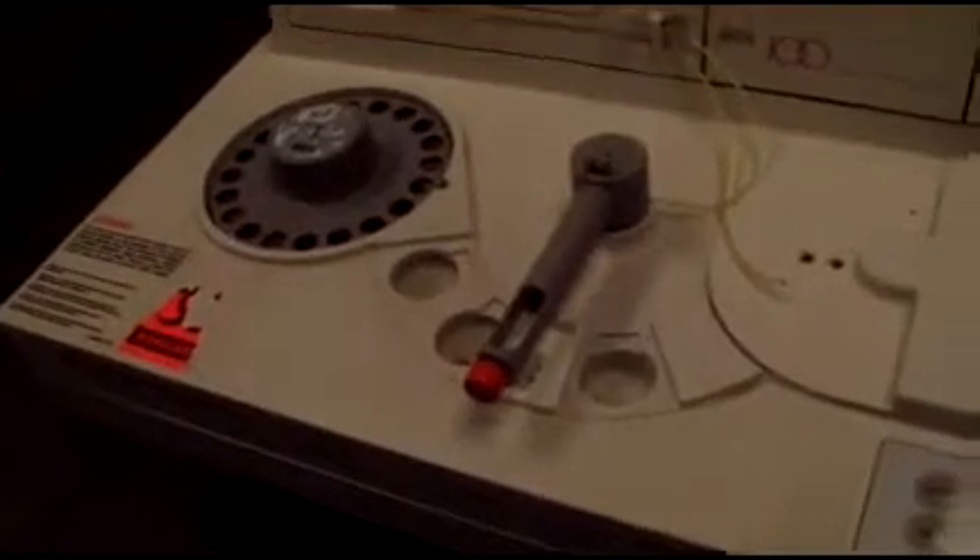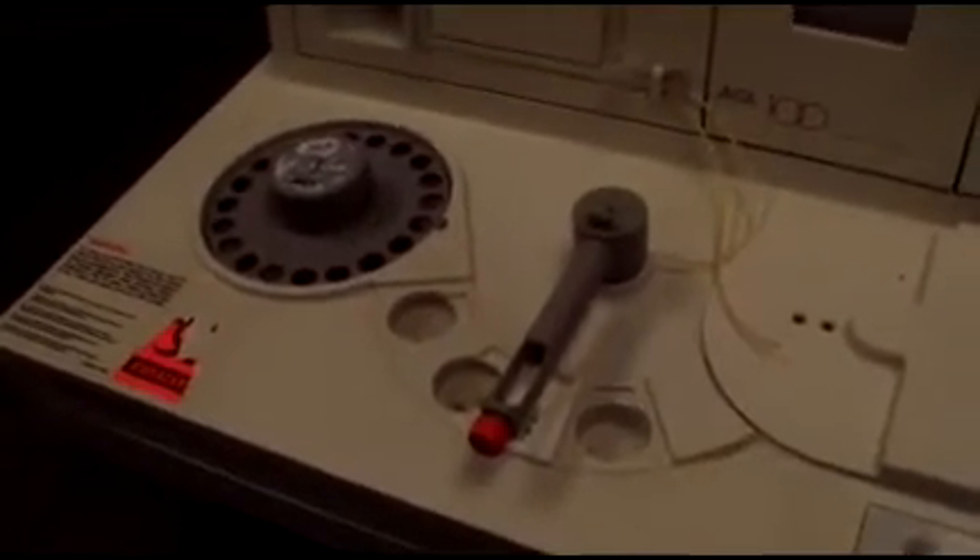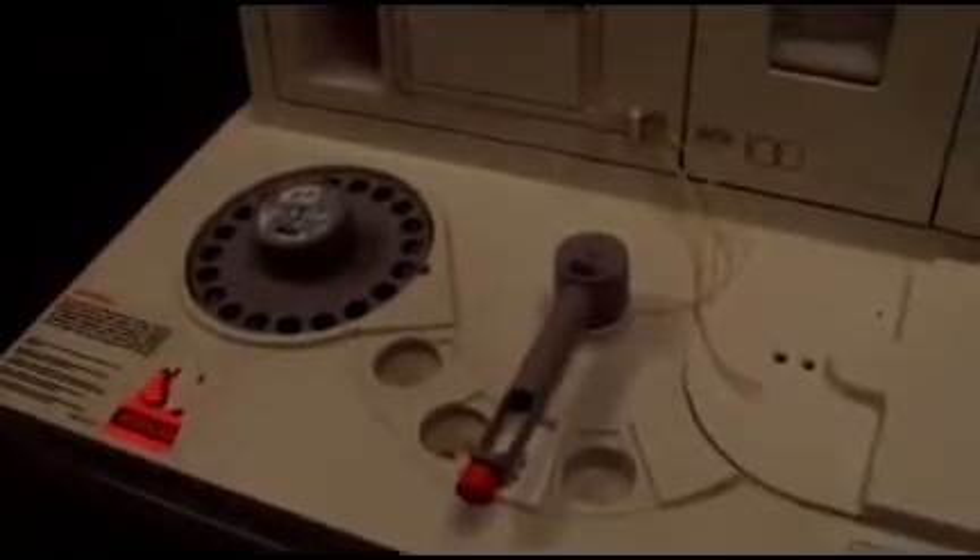Needs to be cleaned up a little bit — there's some dust on it. The printer seems to be suffering. There we go, it's jammed up a little bit there. Printer test.